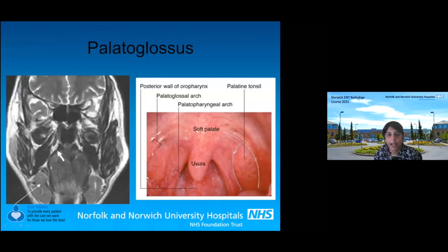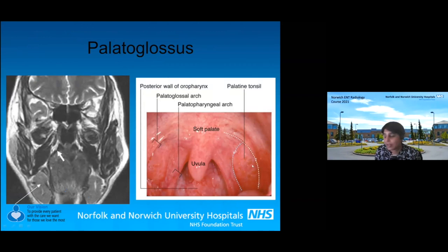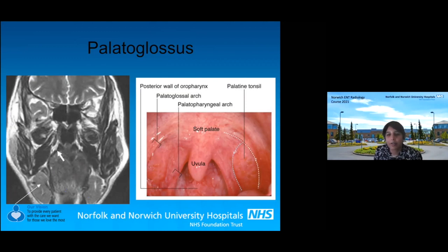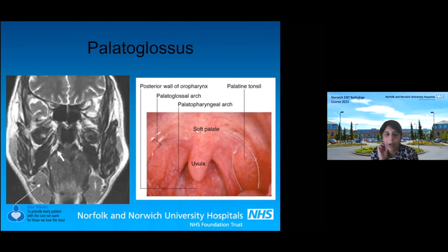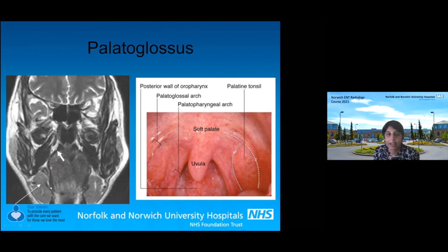Here you can see the uvula, palatine tonsils, the posterior tonsillar pillar which is the palatopharyngeus muscle, and the anterior tonsillar pillar which is the palatoglossus muscle. For radiologists, this is an important muscle — if a patient has a tumor of the anterior tonsillar pillar, the palatoglossus muscle goes all the way down to the tongue base, so we have to follow it all the way down because the tumor could be more extensive than it appears.